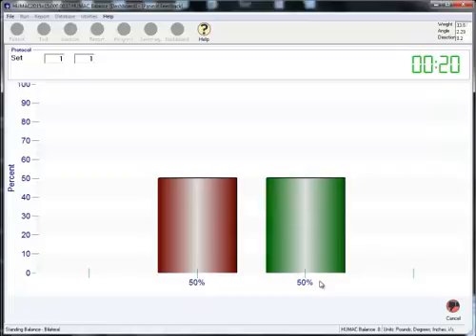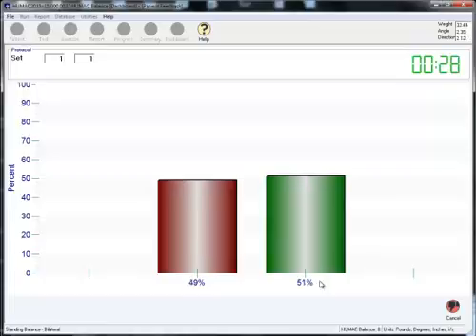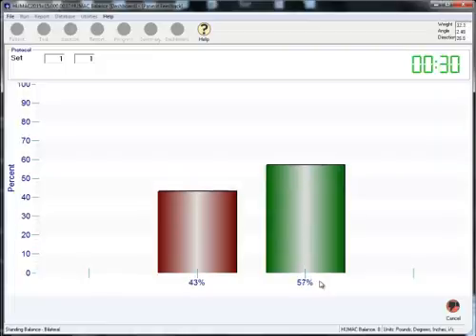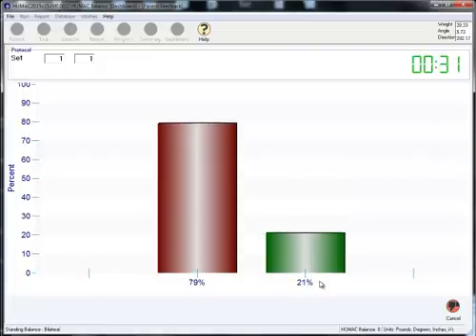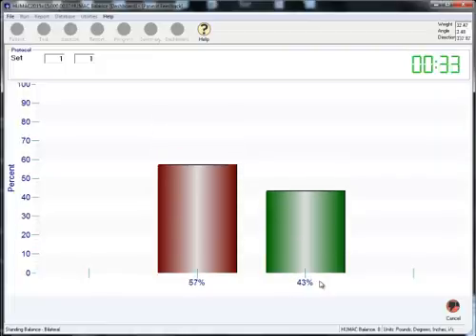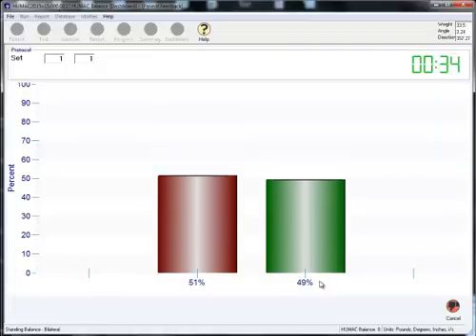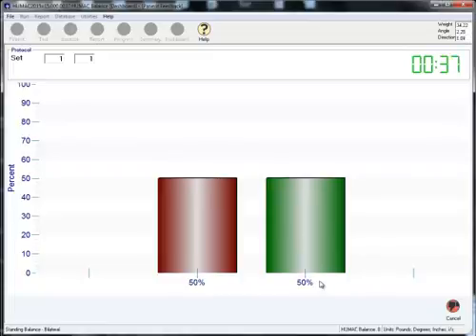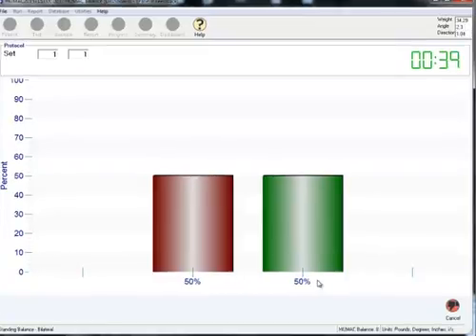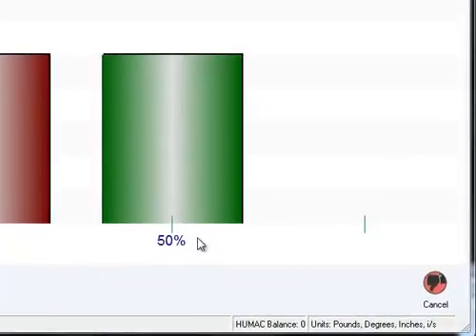Another way to use this display is to have patients do squats or sit down on a chair and stand up. What happens when they move? Do they shift to the uninvolved side or do they keep their weight equal? That's how weight bearing is typically used with the Humac Balance System. To return to the dashboard, select Cancel.